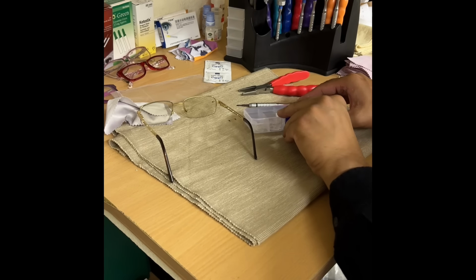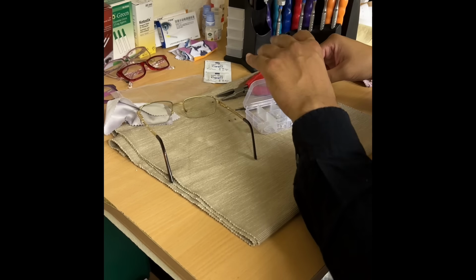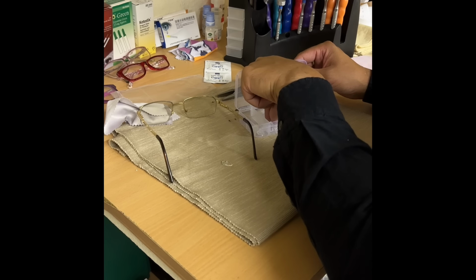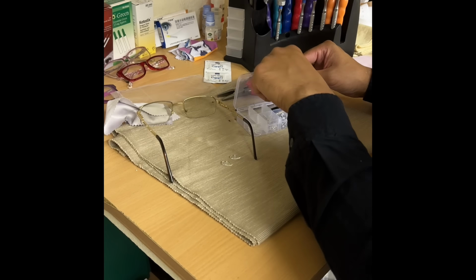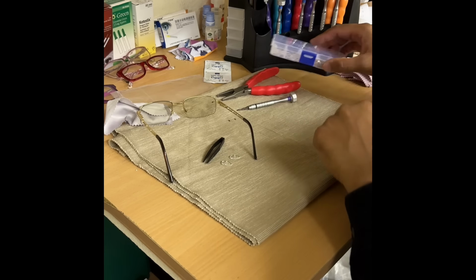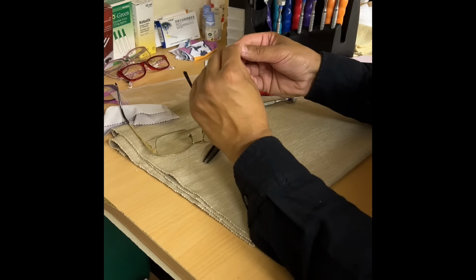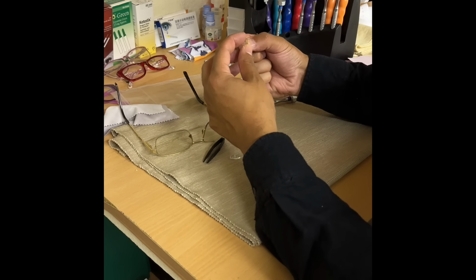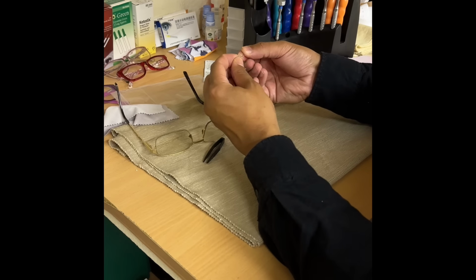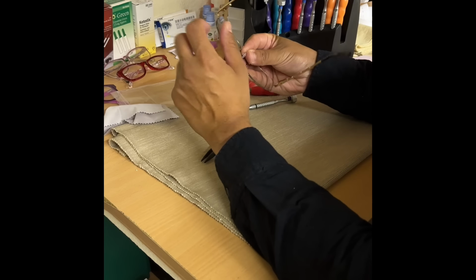Let's have a look at what we've got in here. I'll make my own recommendation for you. Alright, let me show you these, sorry. These soft silicone pads there. They're going to provide excellent comfort on the bridge of the nose, much better than the hard pads. A lot of people are switching to these now.